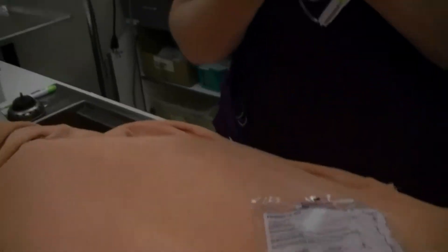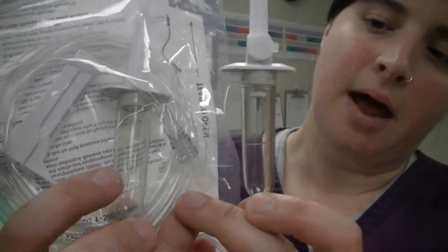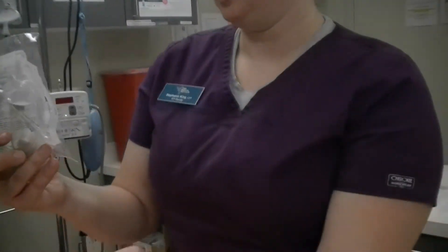Another way you can tell if you already have a line on a bag is if you look in the viewfinder. You can see that the micro has this little needle pointing down, whereas the macro or standard line does not. So the standard one is going to make bigger drops. This is a micro line — 60 drops per milliliter.